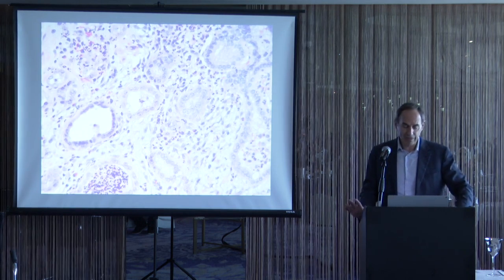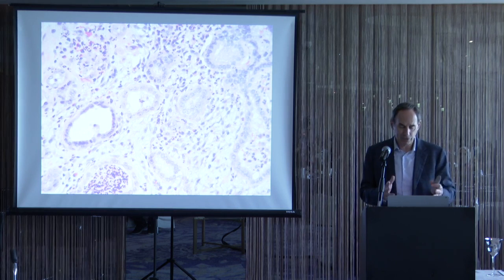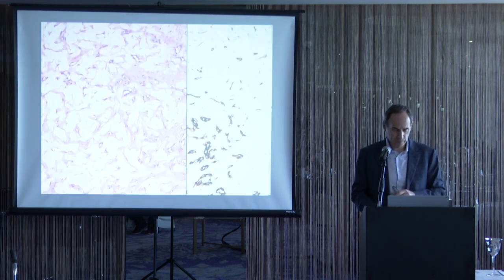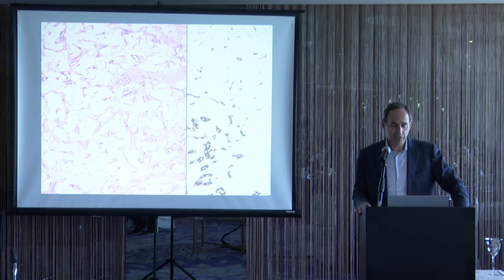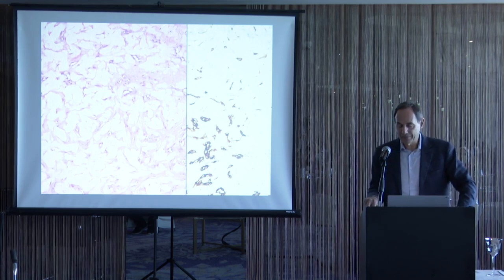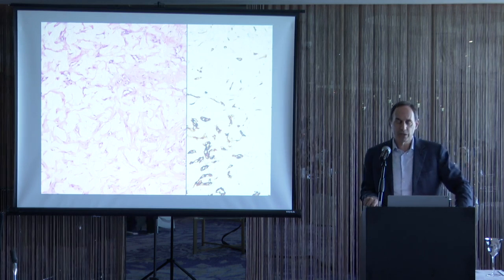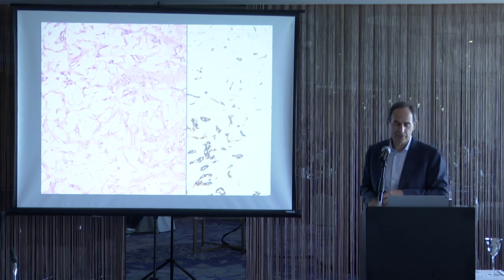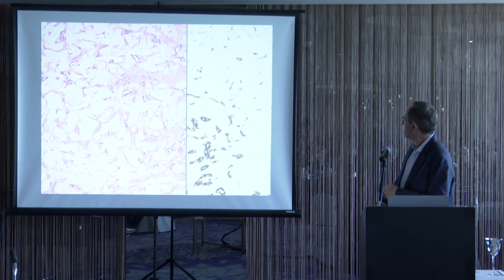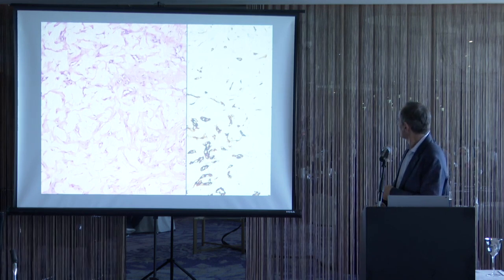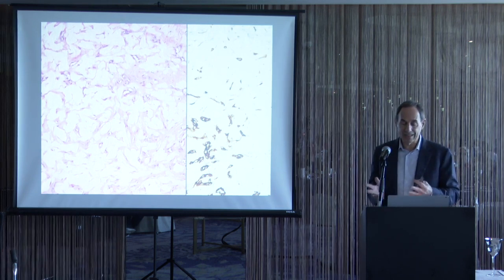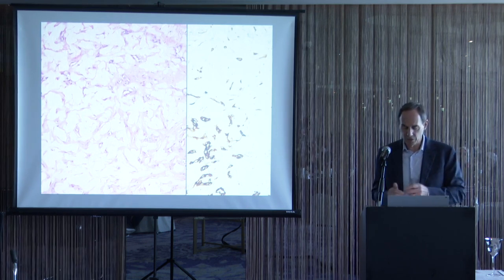Nephrogenic adenoma always occurs within an inflammatory background. In the prostatic urethra, this is helpful because prostate cancer typically lacks admixed inflammation. There is also an unusual fibromyxoid variant of nephrogenic adenoma — first described by this group — where nephrogenic adenoma sits within a bluish hyaline matrix. Initially you may not recognize the lesion, but slit-like spaces are present and keratin staining highlights compressed tubules within the fibromyxoid stroma; these are PAX8-positive.